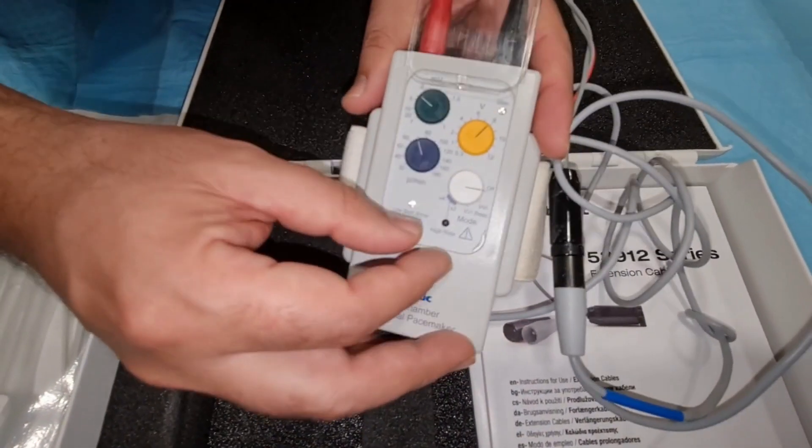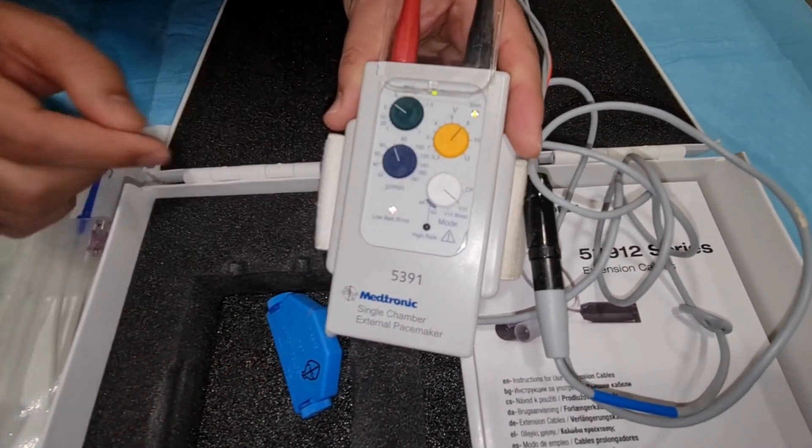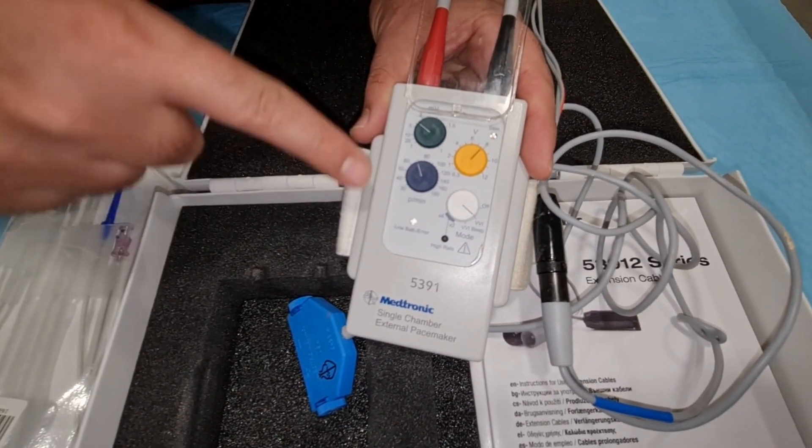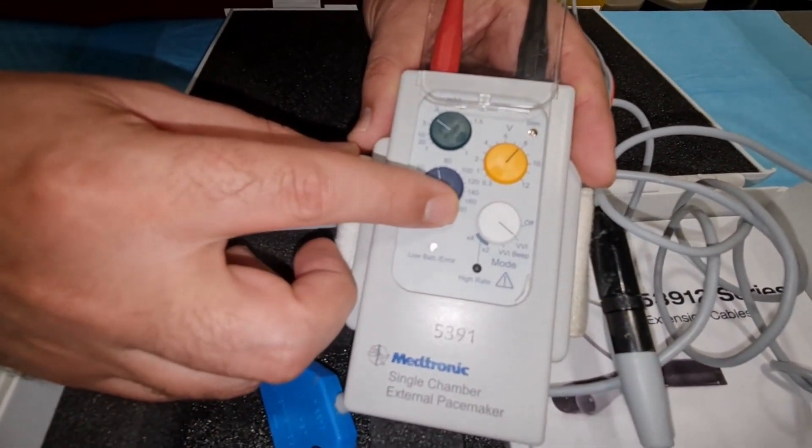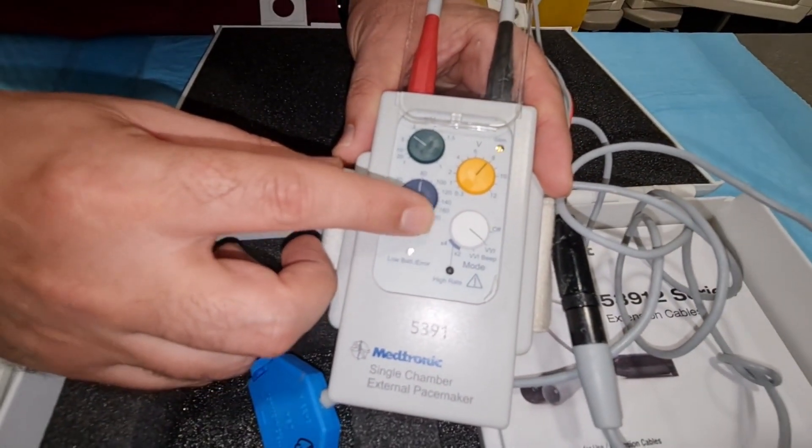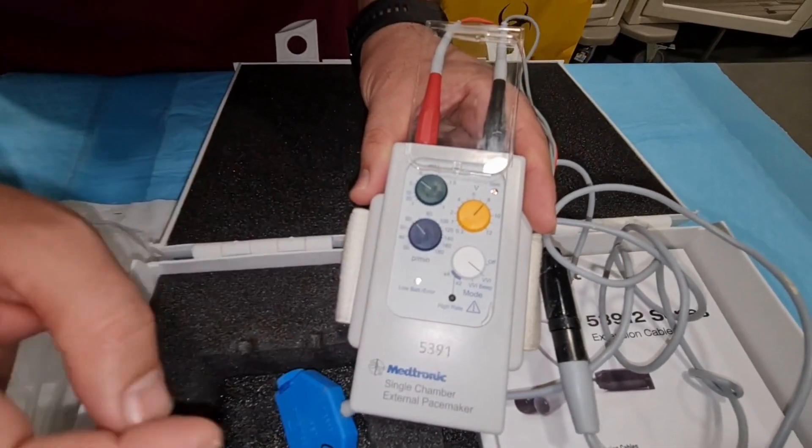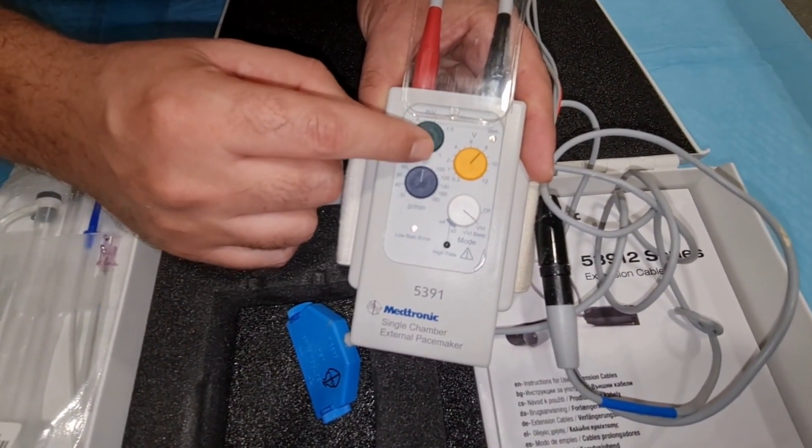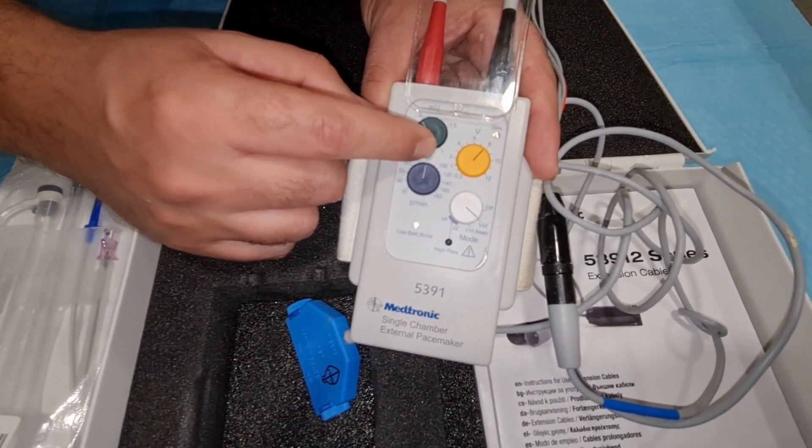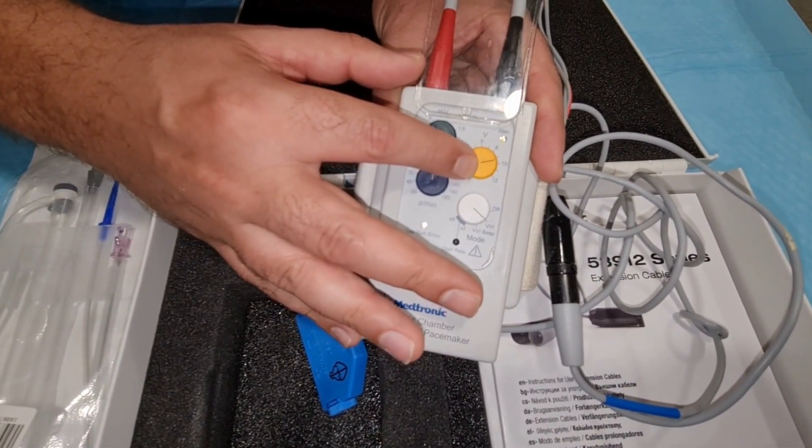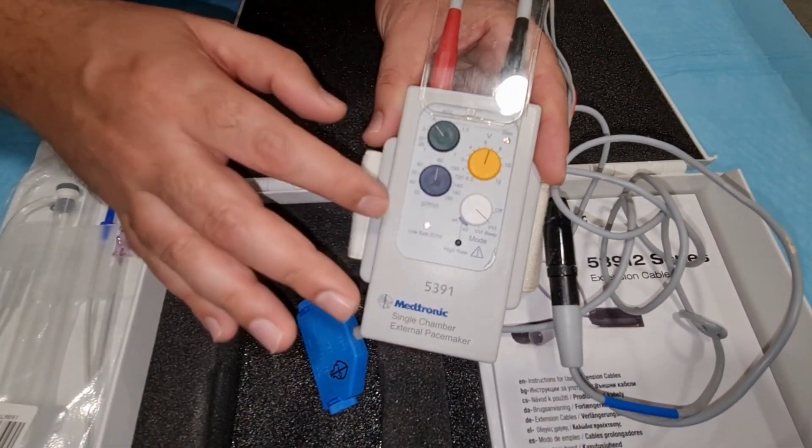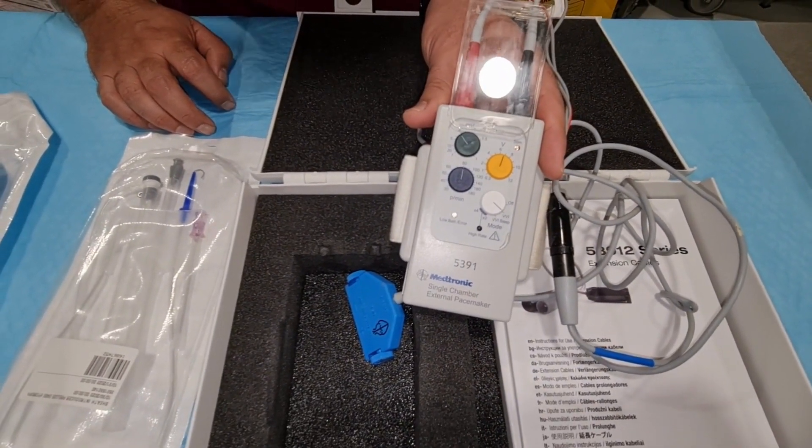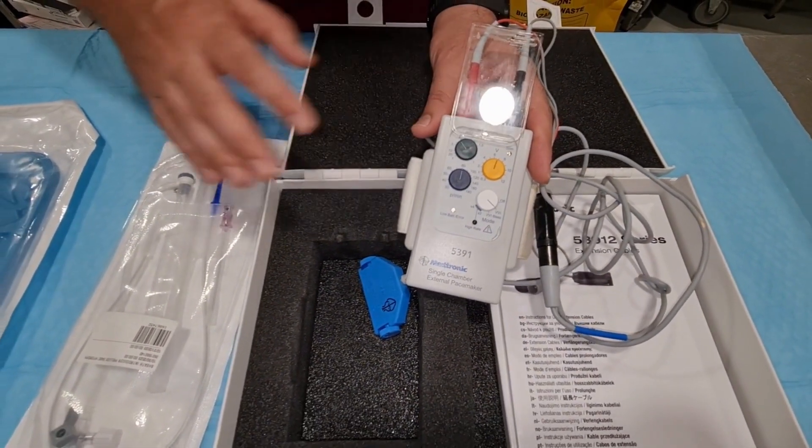Now, let's turn on the pacemaker, the generator. Rotate it to the VVI mode. You will see the bulb sign here. This is for the heart rate. You can put it on desired heart rate. If you want to put it on AT or backup, you can just play or rotate on this. This is for the sensitivity. What sensitivity you want still depends upon the threshold. And this is for the output. It already depends upon the cardiologist's required or desired parameters. This is how it works.